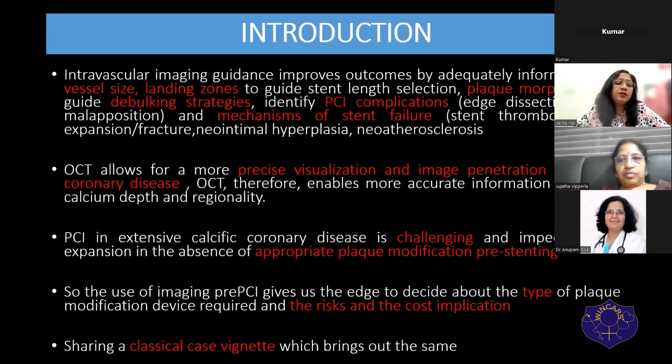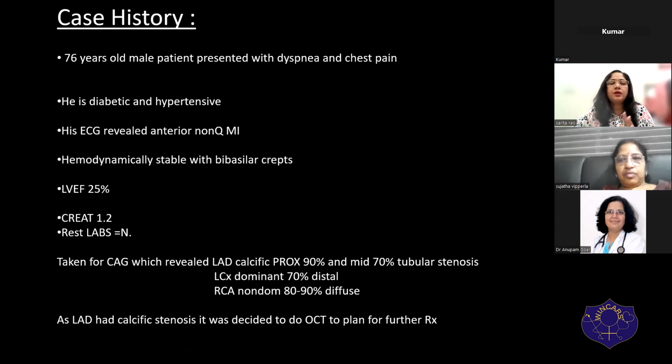Imaging helps us have very precise visualization and penetration in calcific disease. Calcific disease in itself is very challenging, and in many trials the presence of calcification has been associated with worse outcomes. So I'll show a classical case vignette which brings out the situation.